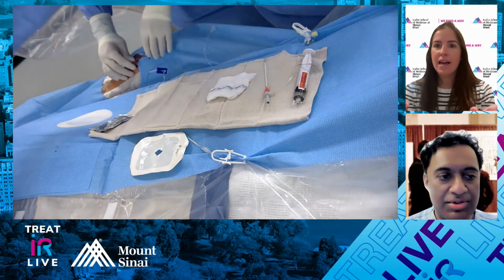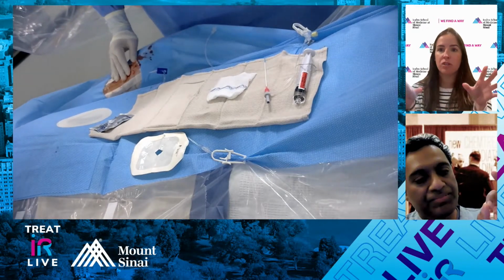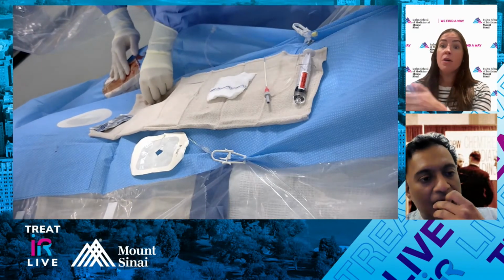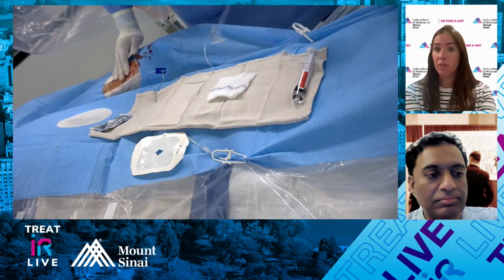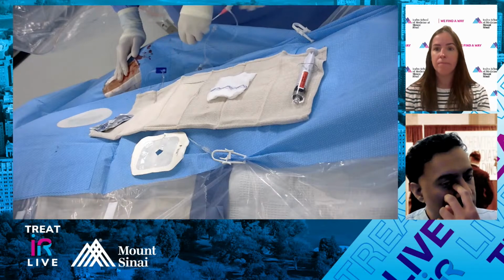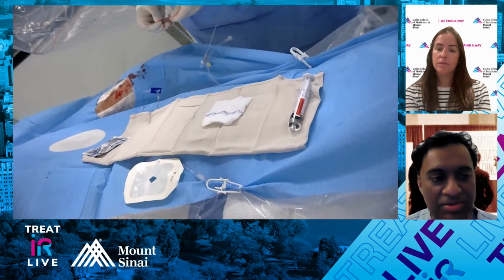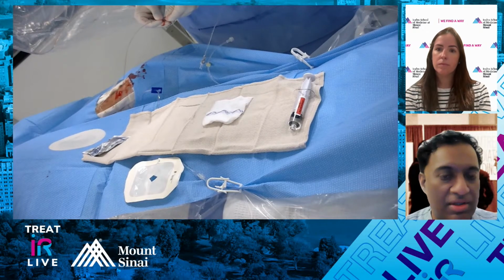Joji, can you talk about that a little bit more, the options we have here? It looks like the plan is a staged approach, but you're talking about an iliac limb. Can you give us the options and run us through them? Yeah, I think hypogastric embolization is fairly safe, especially if you stay proximal to the anterior posterior division.